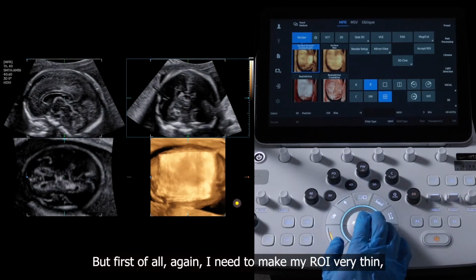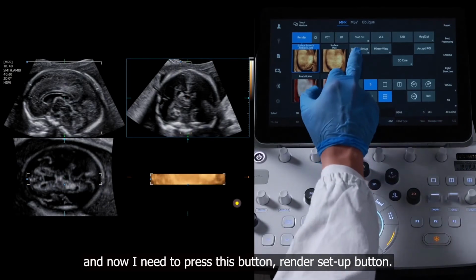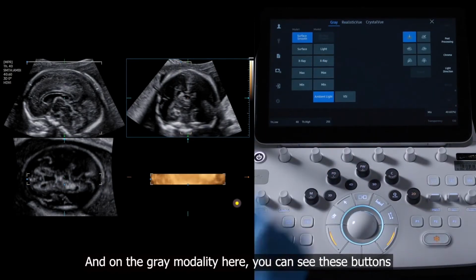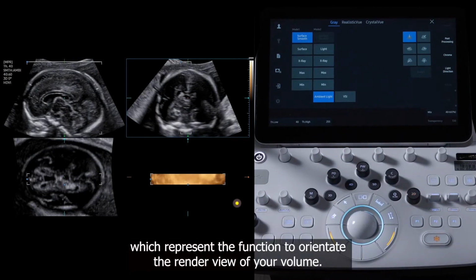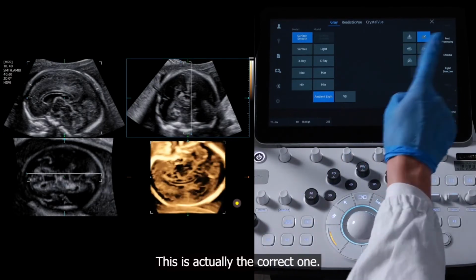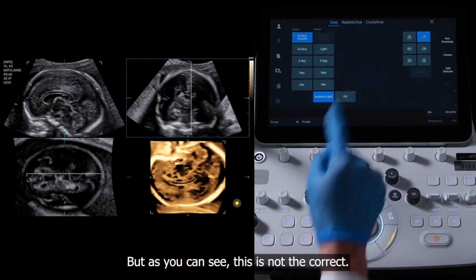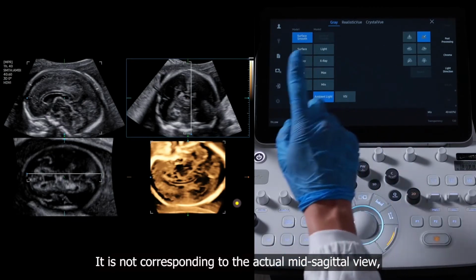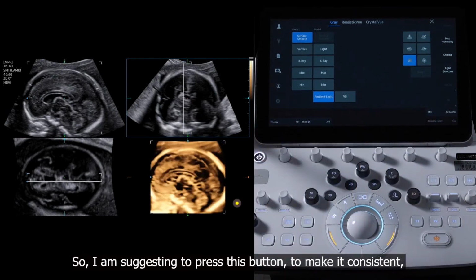But first of all, again, I need to make my ROI very thin, and now I need to press this button, render setup button, and on the gray modality here you can see these buttons which represent the function to orientate the render view of your volume. So this is not correct. This is actually the correct one, but as you can see, it is not corresponding to the actual mid-sagittal view, which is shown at the top left of the screen. So I'm suggesting to press this button to make it consistent.